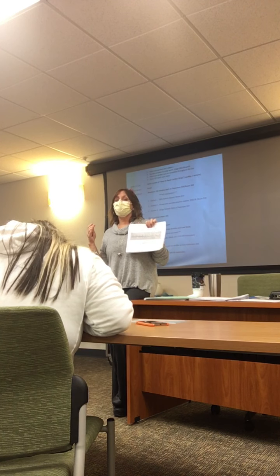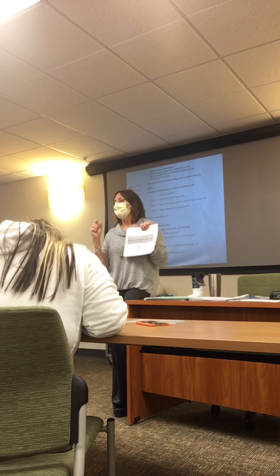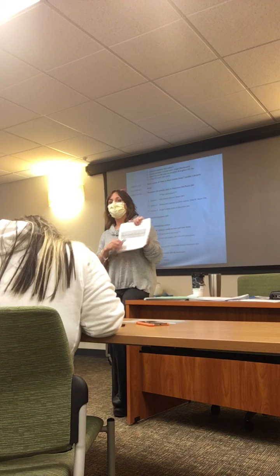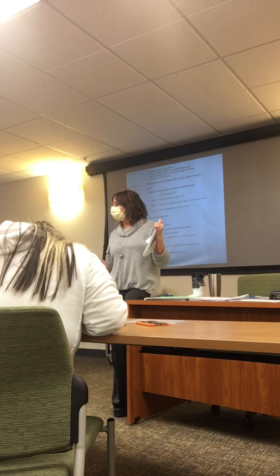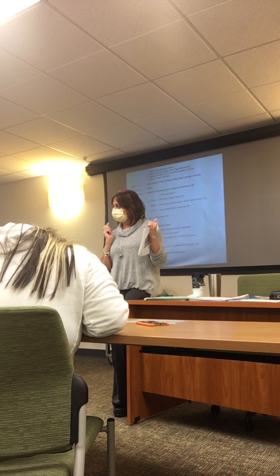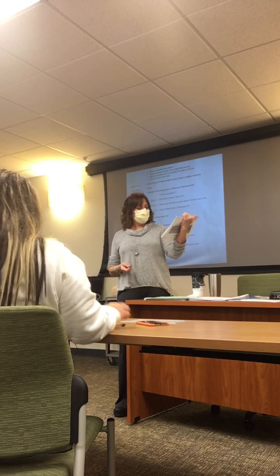And don't worry, for the exam when you have to measure a PR interval, it's not going to be, is it 3 or 4? It's going to be, is it 2 or 5? So as long as you can get in the ballpark. So if there's 4 little boxes, what's my PR interval? 0.16. How'd you get 0.16? 0.04 times 4. That's how you figure out the intervals.